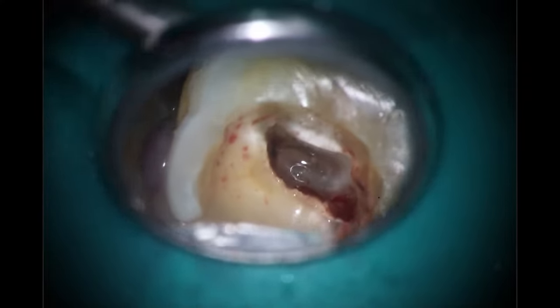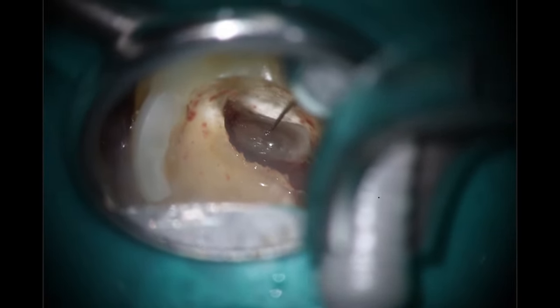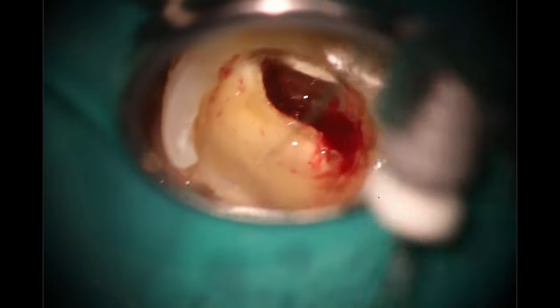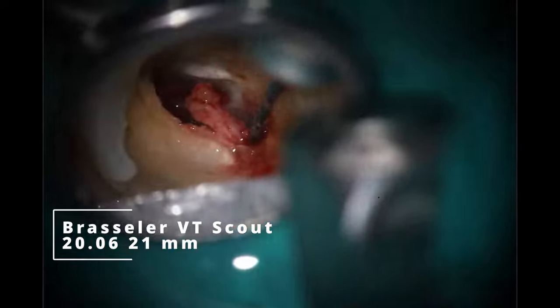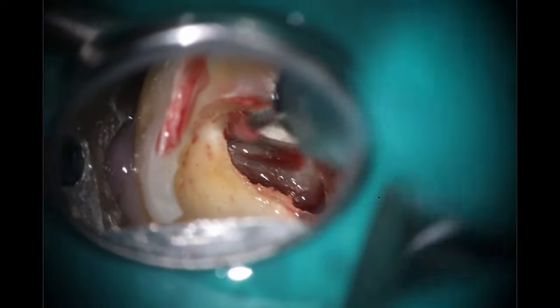At this point I know there's an MB2. I have looked at the CBCT — you'll see slices from that in a minute. What I like to do for my MB2s is start brushing off of where the MB1 is. What I like to do is almost draw a line between your MB1 and your palatal, and along that straight line move slightly off to the mesial and almost make like a comma shape. You'll see where the MB1 is going in, a little bit of a bend on the file. There's where the MB2 is — didn't really get too far down, maybe three to four millimeters, but sometimes that's all you can get. We need to remove that coronal pulp tissue. It's always cool when you get the whole pulp tissue out in one solid piece.